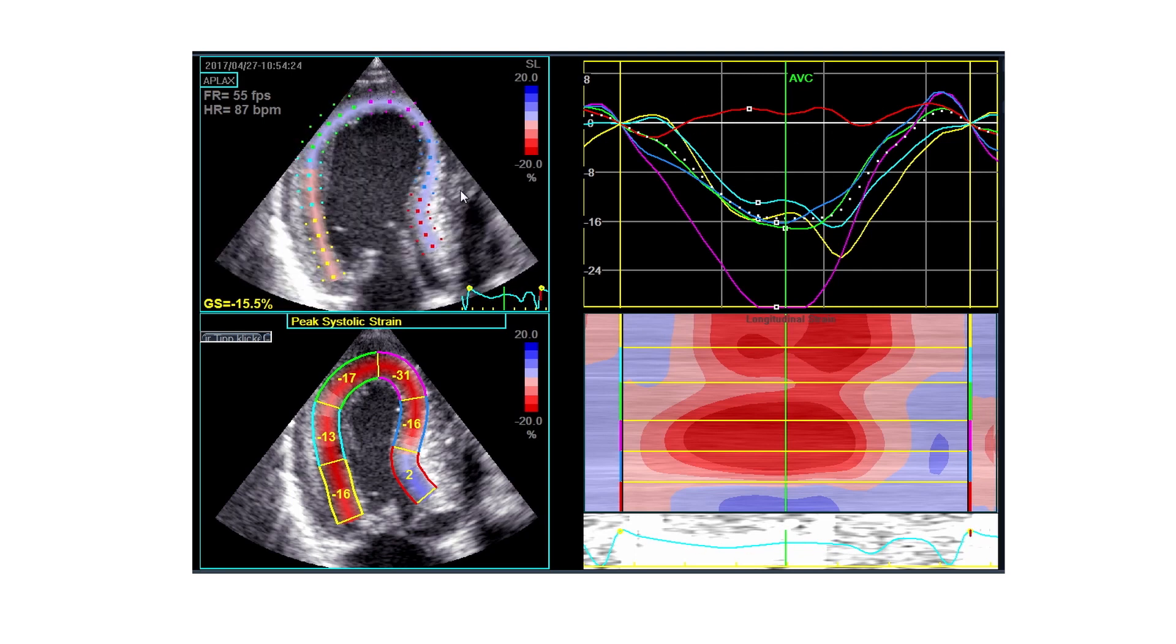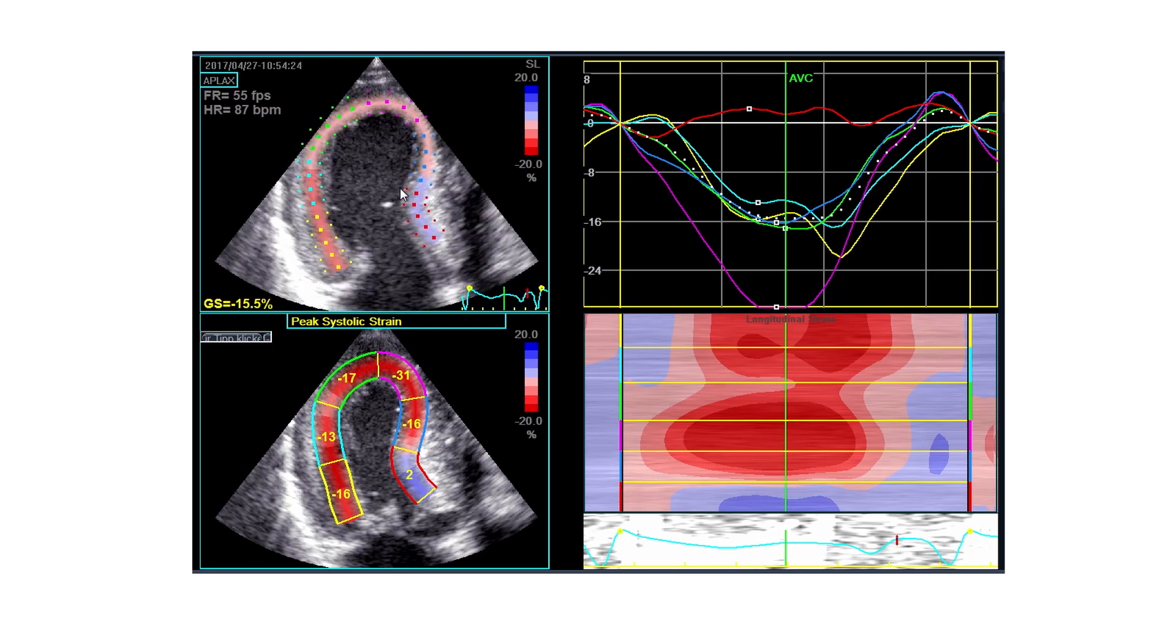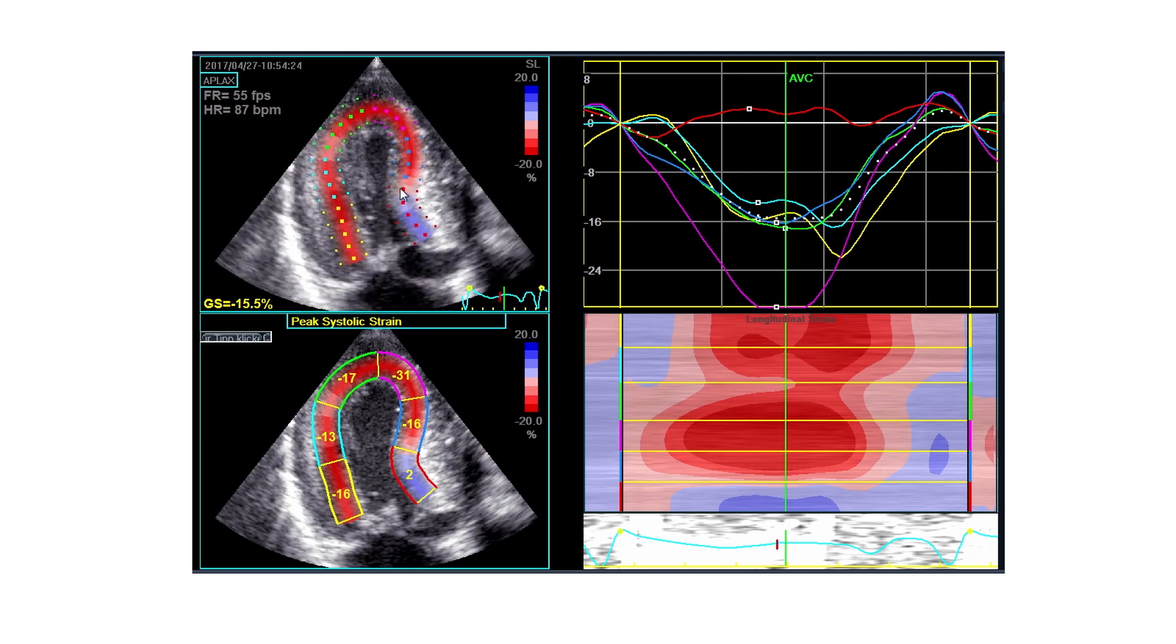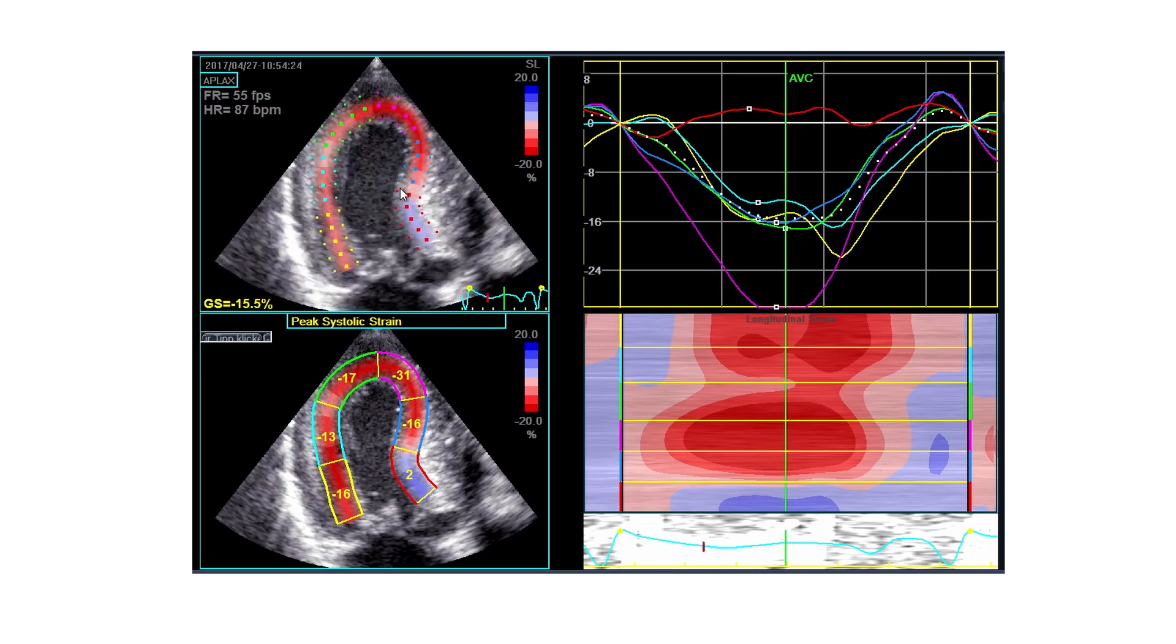And this is actually the segment which also shows the most pronounced hypertrophy, right? So it seems as if speckle tracking also shows us those segments which are more diseased than others, and frequently it is actually the basal septum or at least parts of the septum. And I think this is an important issue when discussing this patient, for example, with a cardiac surgeon who might want to perform myectomy, to really know where the problem is going on.